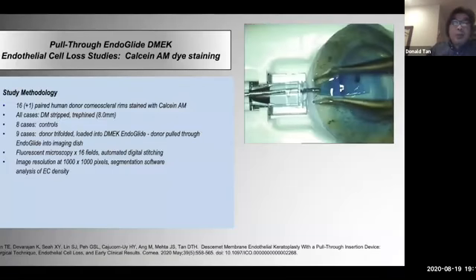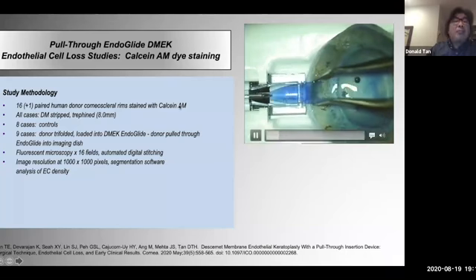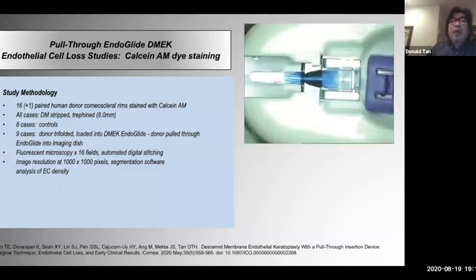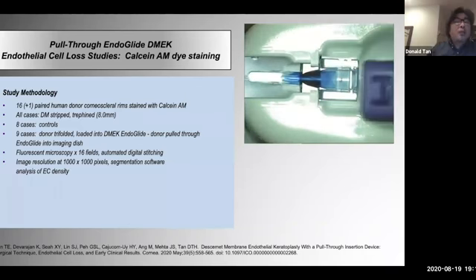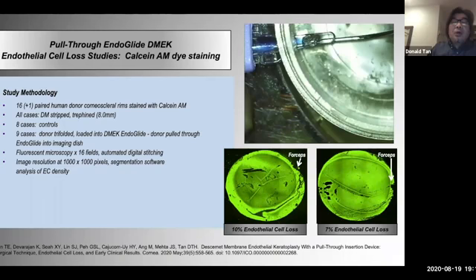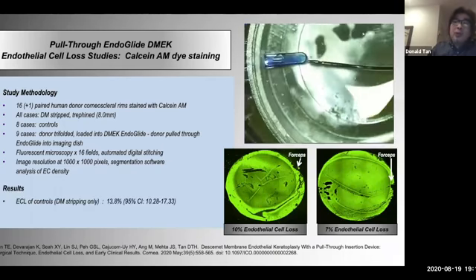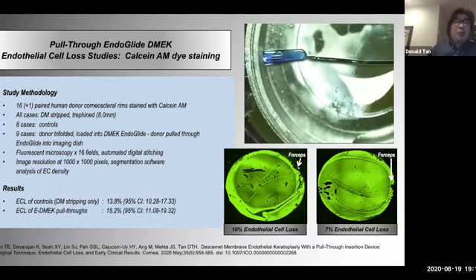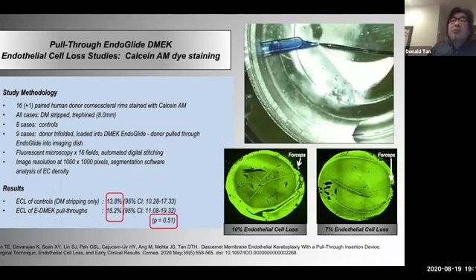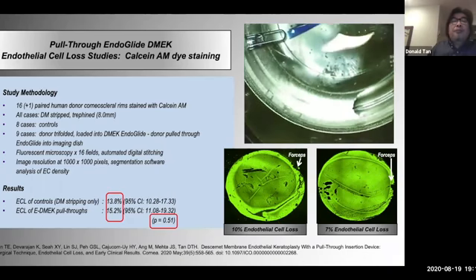So in the original paper, which was published actually just in May this year, we did this in the lab, and we looked at some paired donor corneas. We stripped both of them, and then one we pulled through like this, and the other one we just left alone. And you see there's about 10% cell loss. You can see a bit of forceps damage. But bottom line is that the controls, where we just stripped the tissue, you already lost 13% of the cells. And with the pull through, we didn't really increase that loss. So 15%, there's no difference. So you can do all of this, and you don't actually damage the tissue that much.